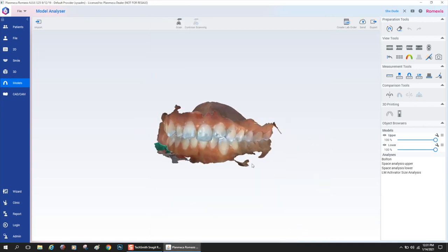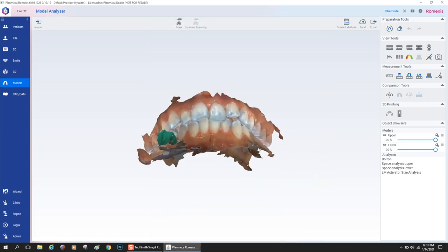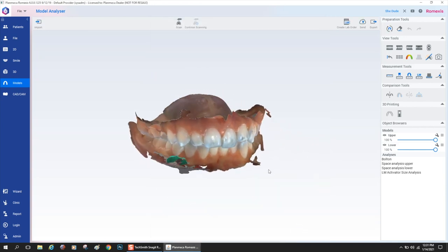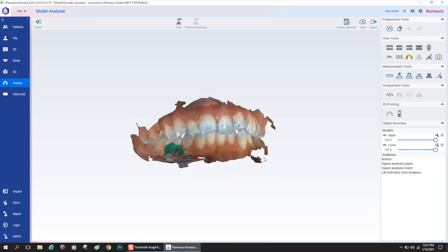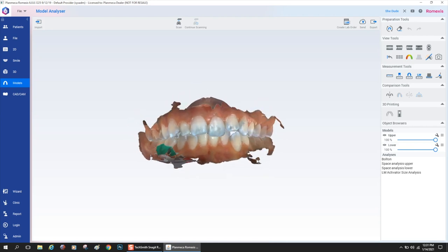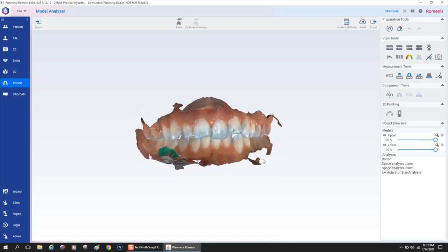Once that's done and the orientation is set, it throws you into this workspace where you get to do all sorts of things.